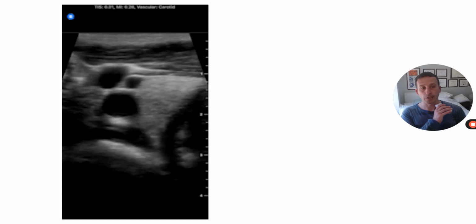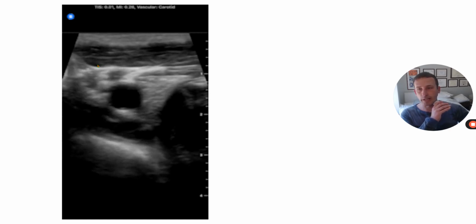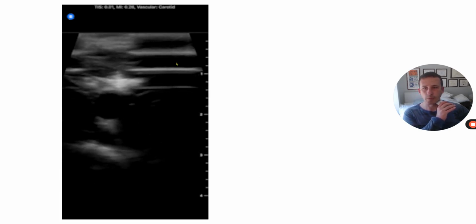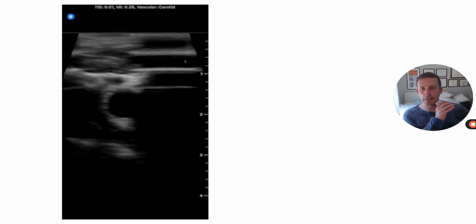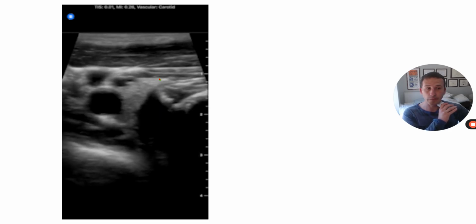We're just tracking the jugular up in a short axis view until we can see it almost completely collapsed, so like right there. And then we're taking pressure off. Notice how the probe's coming off the skin, and you're seeing this artifact here because we're just trying to generate as little pressure as possible. Make sure it's not us squishing the jugular vein.